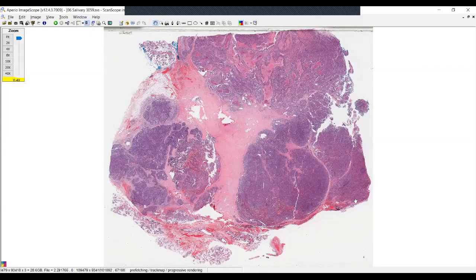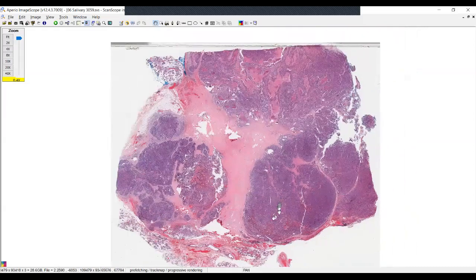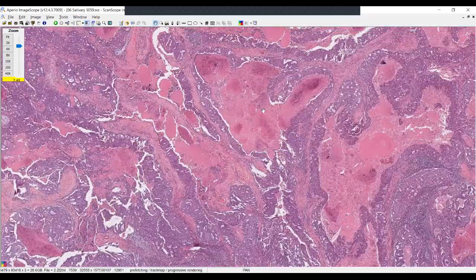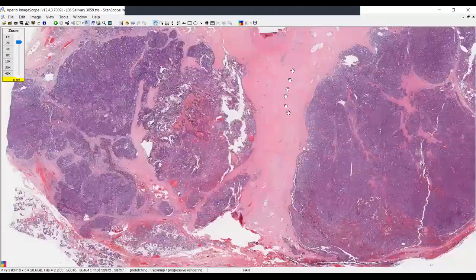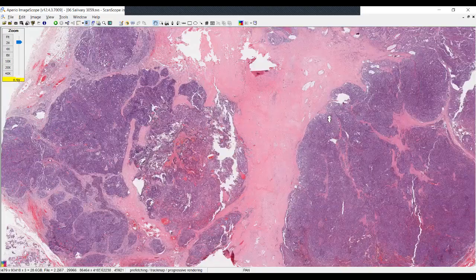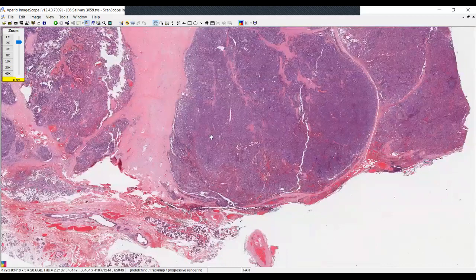This is an example of the imaging that you can see with, again, salivary gland parenchyma around the periphery. And I think in this case, you can tell that there are multiple nodules of tumor. They are expanding out into the adjacent tissue with areas over here showing remarkable comedonecrosis. So already I think you can tell that you're dealing with a tumor that is fairly high grade. Again, I usually do try to look in the central portions of these tumors to see why they have undergone degeneration or fibrous connective tissue change. But in this case, there was nothing particularly unique in that area.